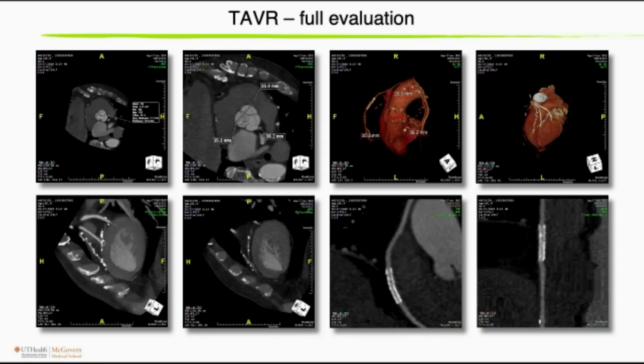In this particular case, we determined also the aortic valve area quite accurately, and I know what the literature says about the agreement with echo, but that's not always the case. Sometimes we see quite significant discrepancies. We can calculate and come up with angles for deployment, even though this is done nowadays more so in the cath lab than based on the CT evaluation.